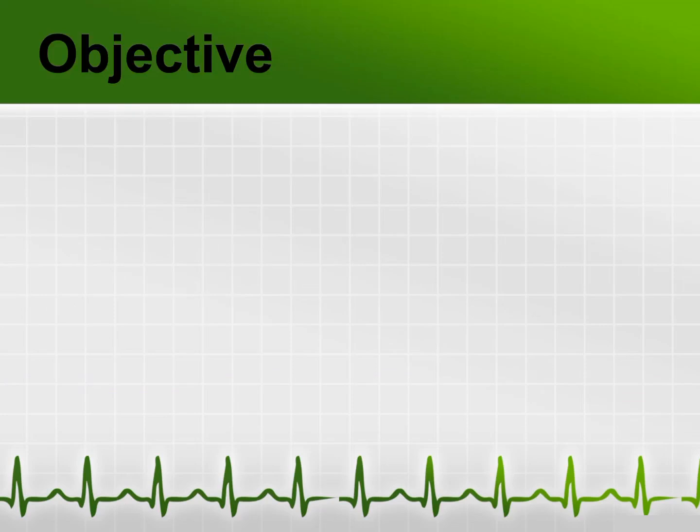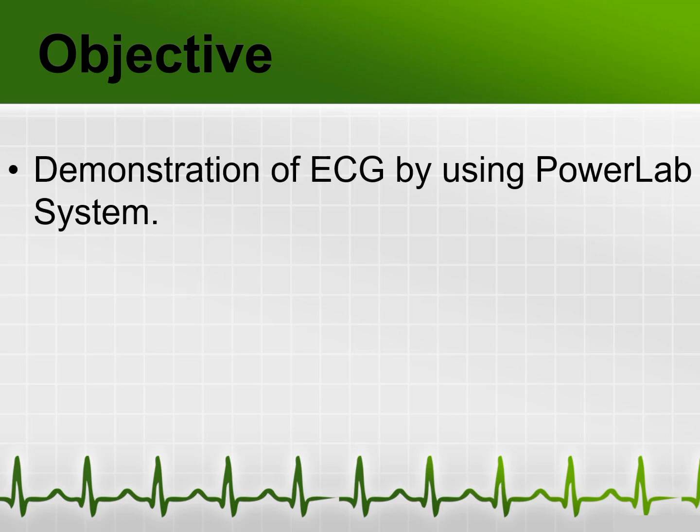What is the objective of this practical? The objective of this practical is demonstration of ECG by using PowerLab system.